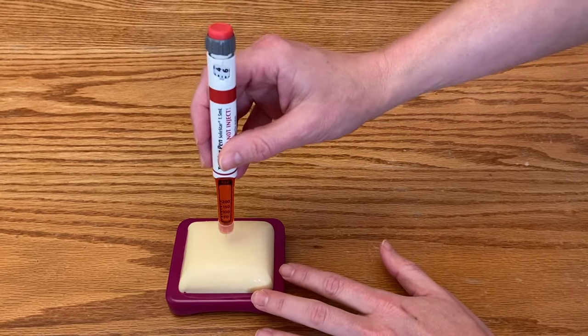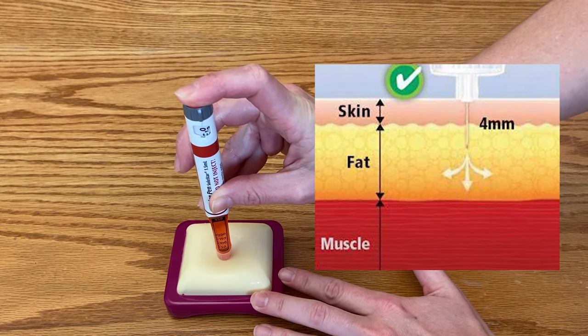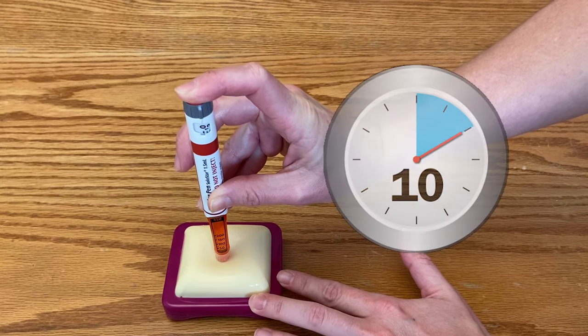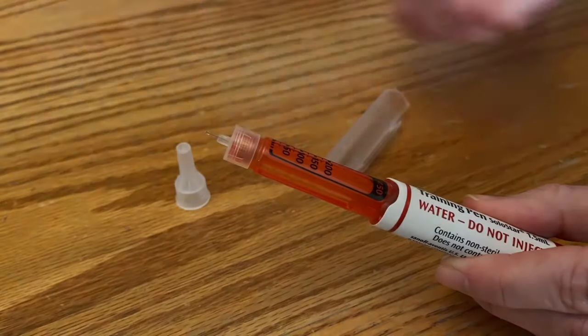Insert the pen needle at a 90 degree angle. Once the needle is under the skin, press the dosing button down and count for at least 5-10 seconds with the button pressed down. Counting will help ensure that the entire dose has enough time to fully deliver.